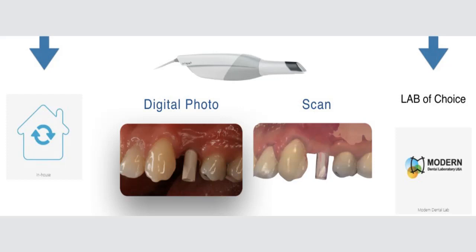If you go for that, make sure that you are scanning correctly, because you have seen some issues not only with the Trios scanner, but also with all the scanners. So we've been very cautious to do it. I've been successful in doing some, but sometimes I still have some small discrepancy. Things are getting better. But there is no doubt that for single units, or for one full bridge on one side and so on, you can easily use it and you're going to be very precise. And this is what we have done.